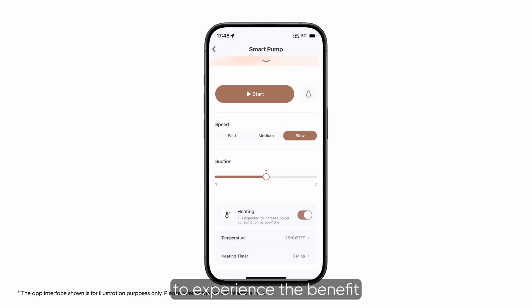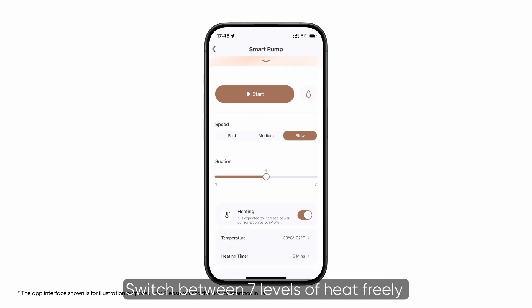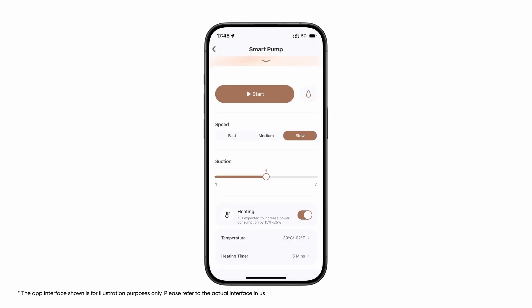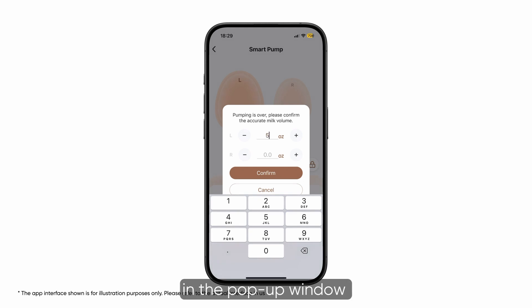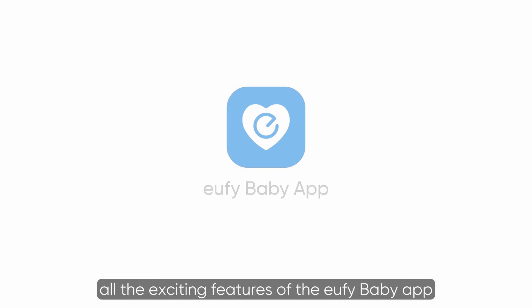You can also turn on heating mode to experience the benefit of heat flow technology. Switch between seven levels of heat freely and set the timer for as long as you like. After each session, you can mark down your output in the pop-up window and review your pumping history. Now get started and explore all the exciting features of the Eufy Baby app.